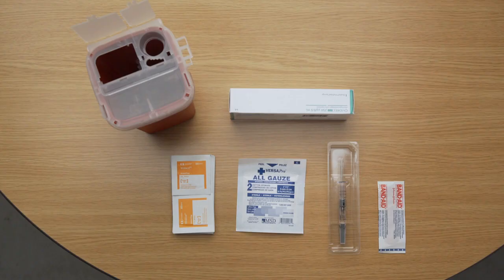Before you begin, be sure to have all of the following items: one Ovidrill pre-filled syringe, an alcohol swab, sterile gauze, a safety container, and a band-aid.